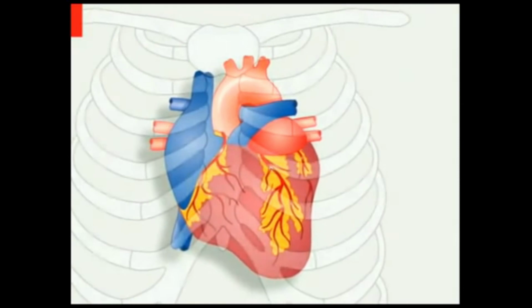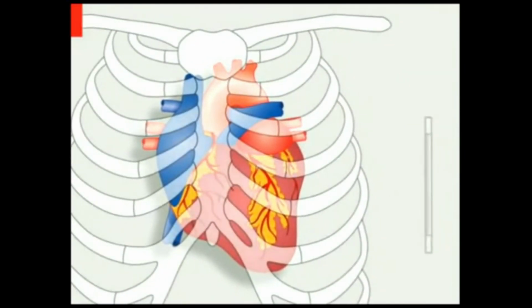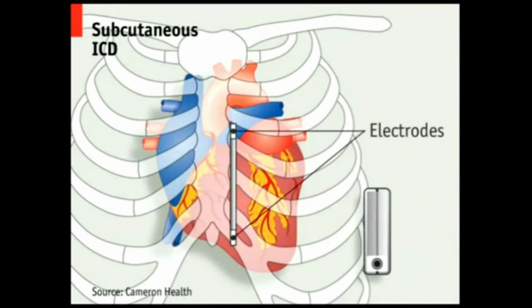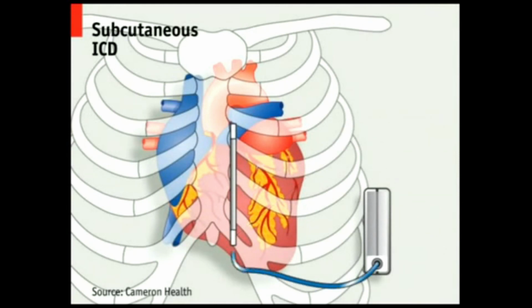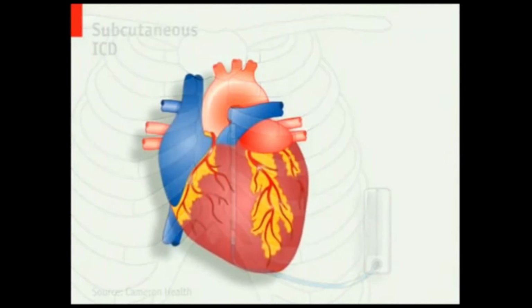This has resulted in the development of new pacemakers that do not depend upon the placement of leads inside the heart. One such design is the subcutaneous ICD, where the lead is placed outside the heart, under the patient's skin. This kind of implantable assist device is life-saving and a need of the heart.